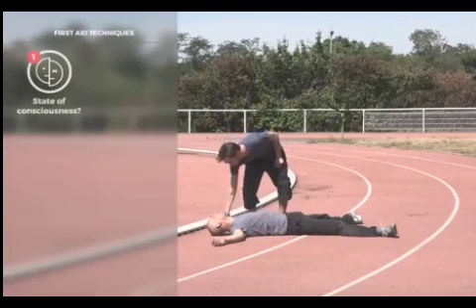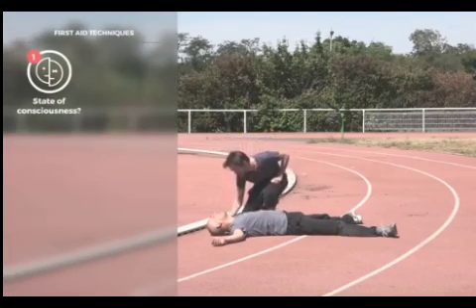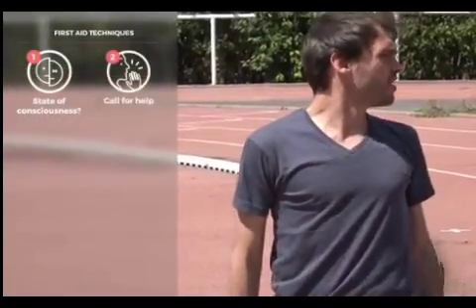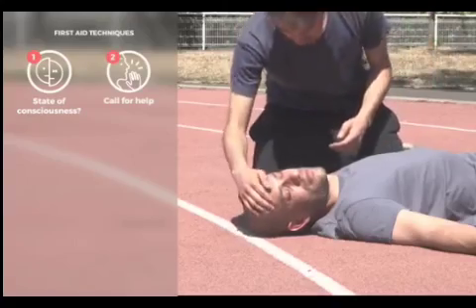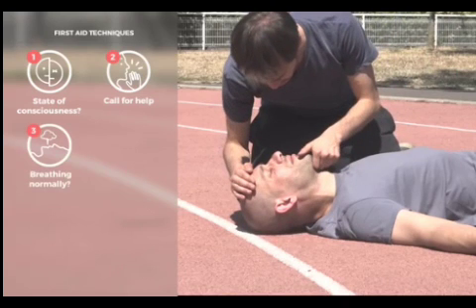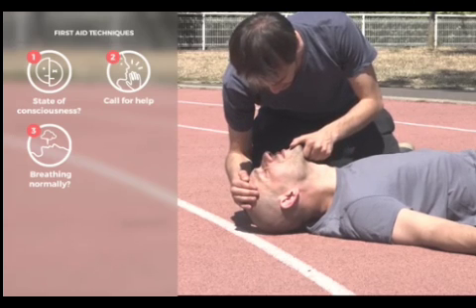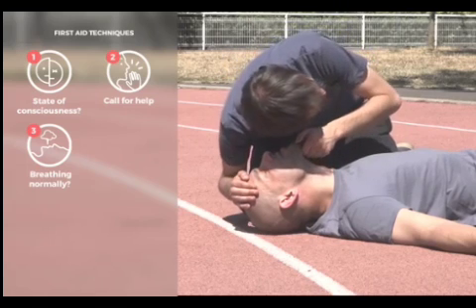If the person does not respond to you when you speak to them, whilst holding their hand and gently shaking their shoulders, call for help if you're alone, and lay them on their back. Check their breathing by placing one hand on their forehead and the fingers of the other hand under the tip of their chin. Carefully tilt their head backwards and lift their chin so as to fully open their airways.